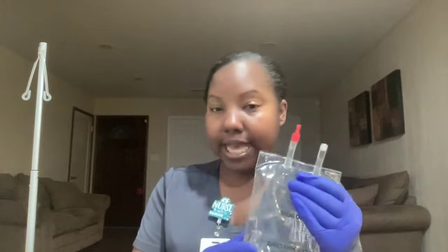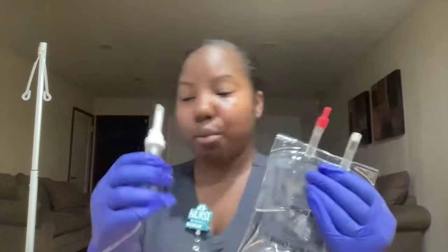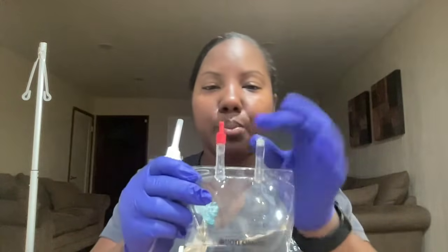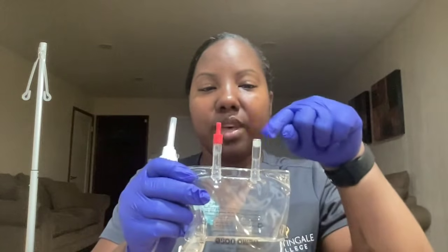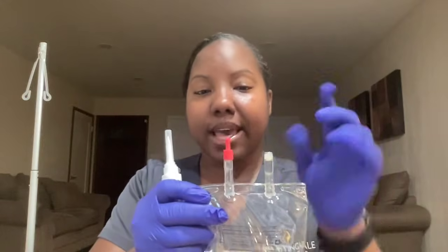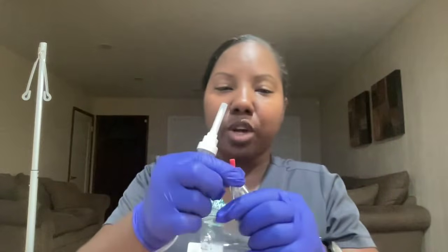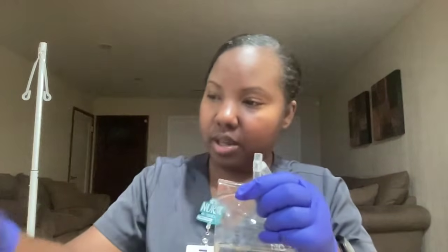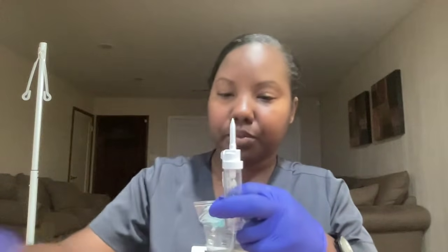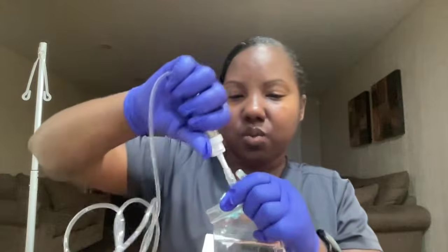Okay, so we are going to begin with the normal saline. We are going to use the primary line for this. On the saline, there are 2 ports. This one, if we wanted to, we could put medicine directly into the bag, but we're not. So we're going to remove this, and then we will remove the spike top, and we'll put it in.